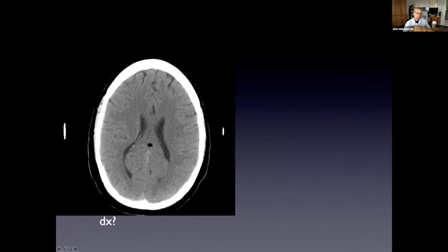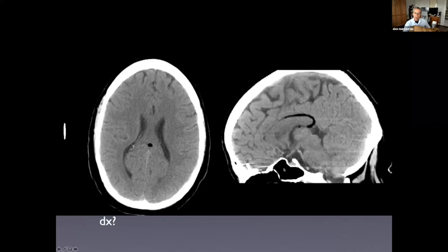Here's another example here. You can see this area of low attenuation in the midline, in a sense of what does this represent? But when you look at the sagittal reconstruction and you can see this, of course, subcutaneous fat looks black here, air looks black. That has to do with the way we've windowed the image, but here you can see pretty clearly this is a pericallosal lipoma. So it's easier to understand a lot of anatomic features when you display them in one of the multiple projections.